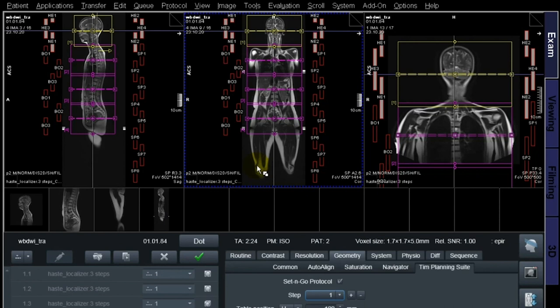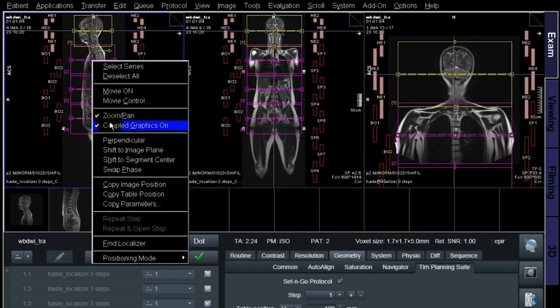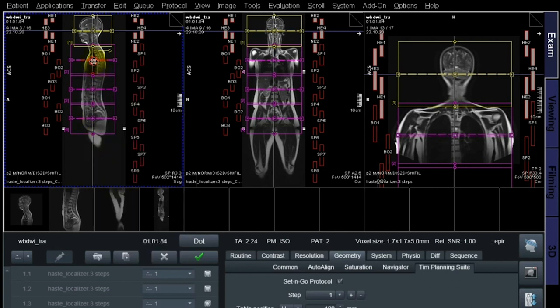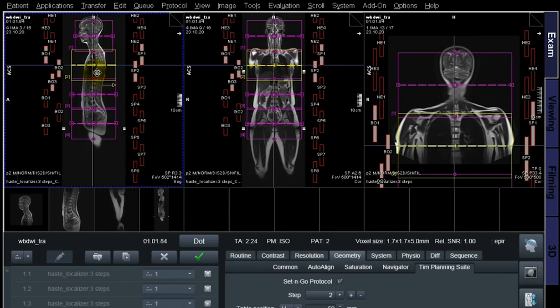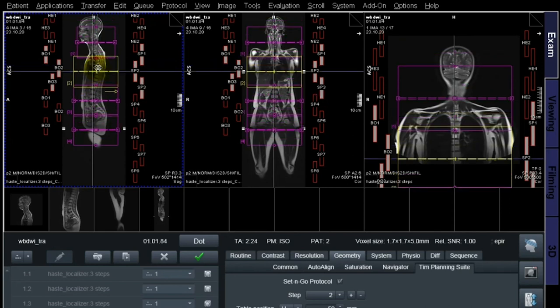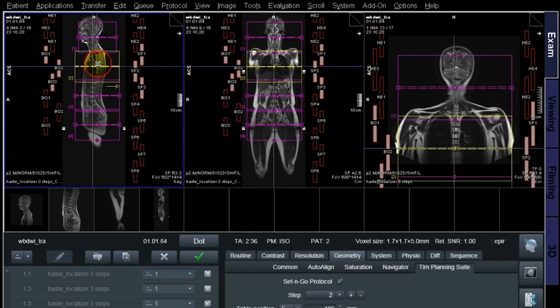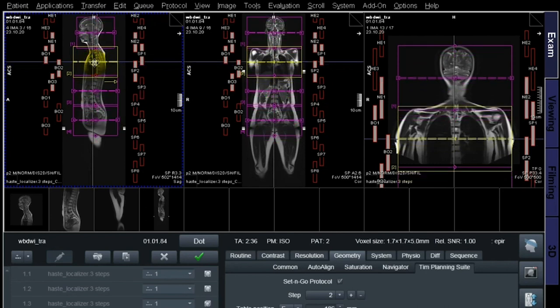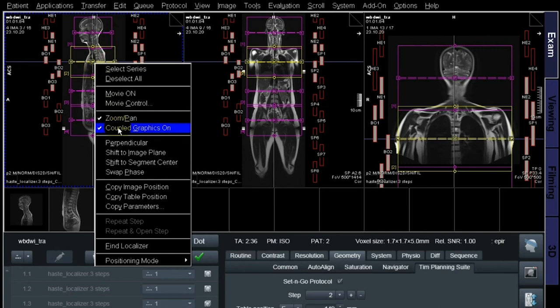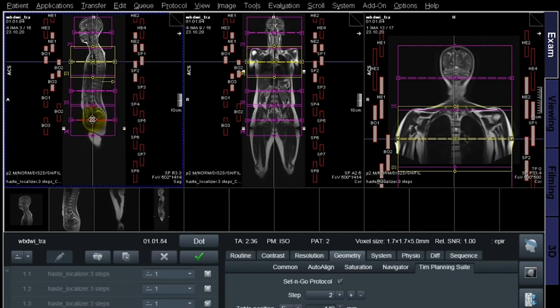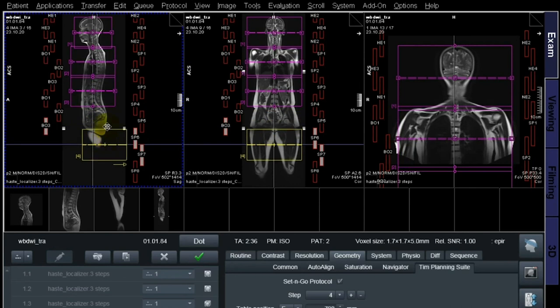To move the Set and Go, remember to have 'Couple Graphics' on — right-click on the screen and select Couple Graphics. That means whenever you move one box, every box will be stitched together. You can see it lags a little bit. If you take Couple Graphics off, you only move one box — it's time consuming.